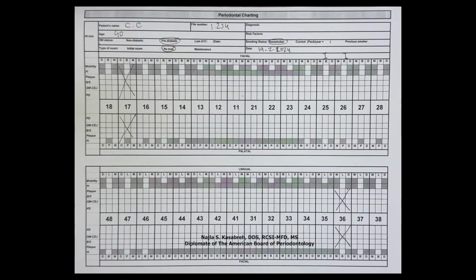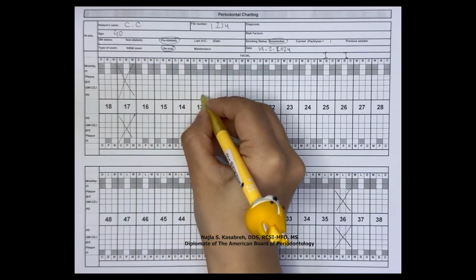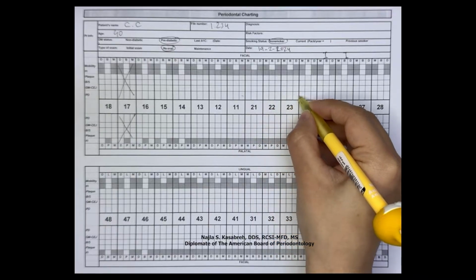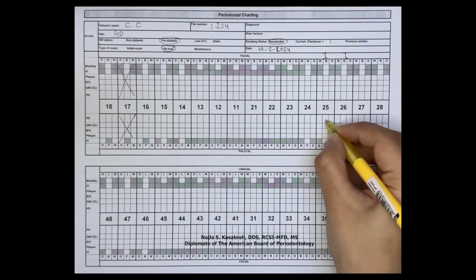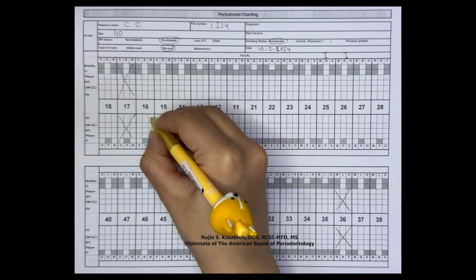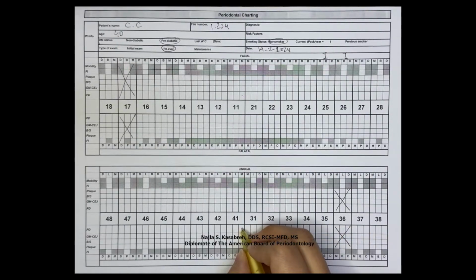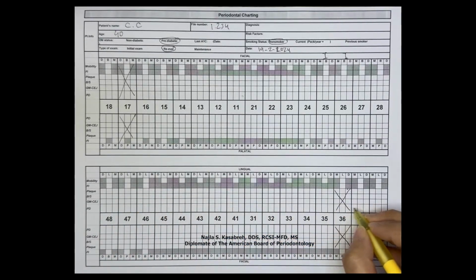The most effective approach to complete the chart is through a systematic method. Begin by addressing the upper right buccal side, meticulously filling each corresponding box. Proceed to the upper left buccal side, then wrap around to the left palatal and subsequently to the right palatal side. Once this is completed, shift focus to the lower jaw. Start with the left buccal side, followed by the right buccal, then the right lingual, and finish the examination with the left lingual side.